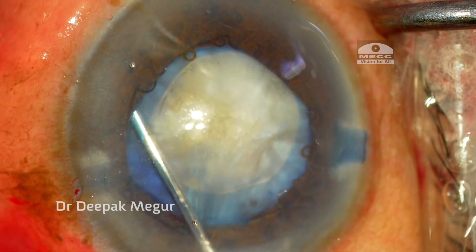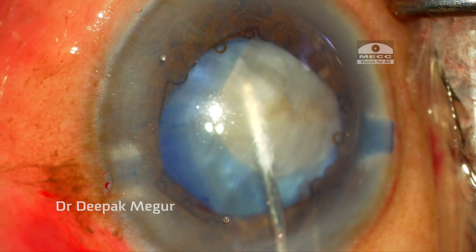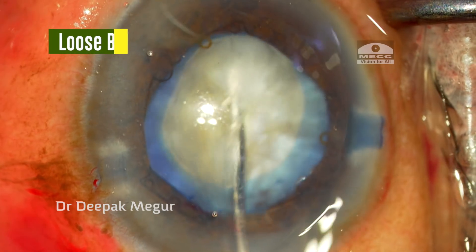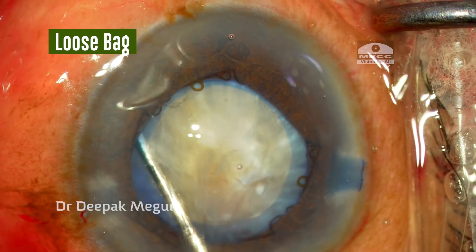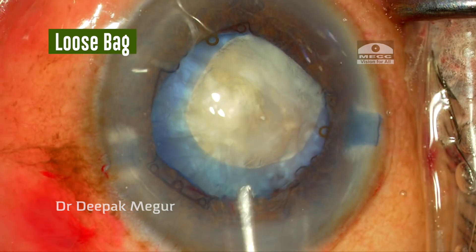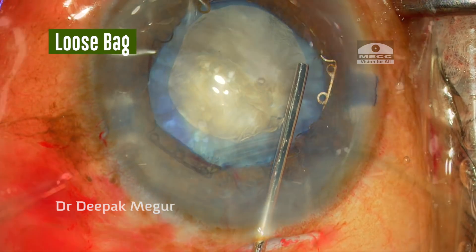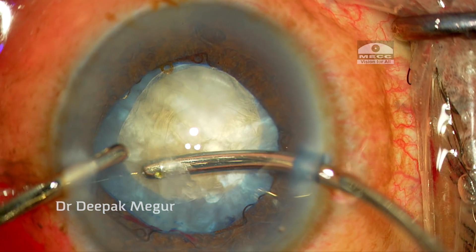I'm doing a little bit of hydrodissection to see how mobile the nucleus is, but I can see that the entire nucleus and the bag complex are moving together, indicating that the zonular health is not great. At this time I decide that I want to use the CTR now itself.